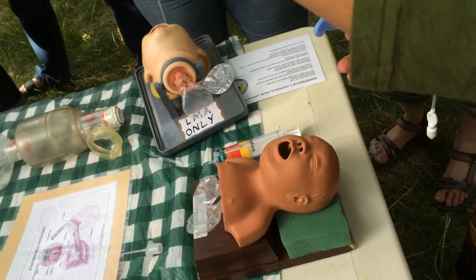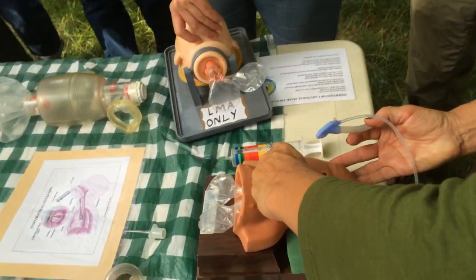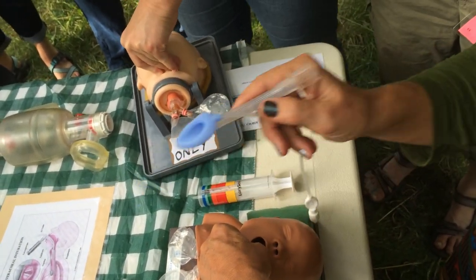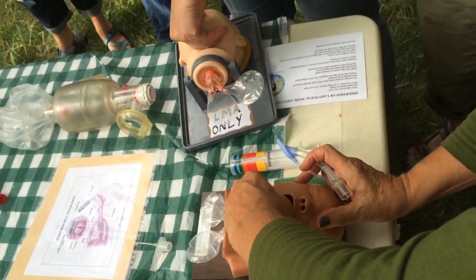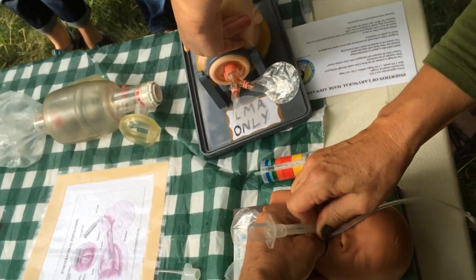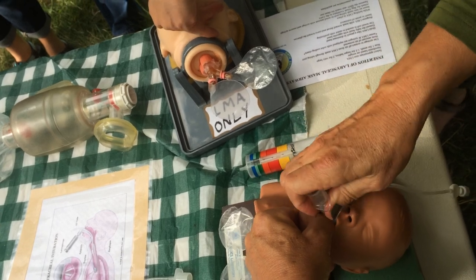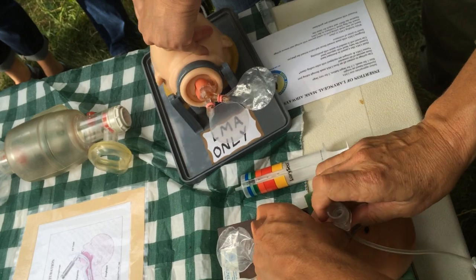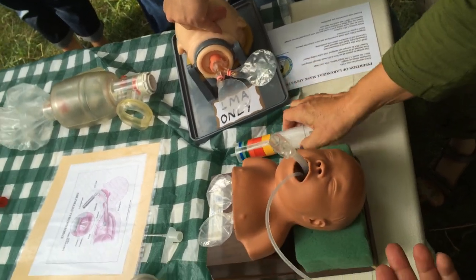Okay. What you want to do is take your non-dominant hand, use your thumb, and go as far back in the baby's throat as you can. And just like we did with the laryngoscope, push the tongue up and make room for putting in your LMA. You advance your LMA right next to your thumb until you feel resistance big time. Don't stop as soon as you feel a little bit. So you go all the way until you feel resistance.